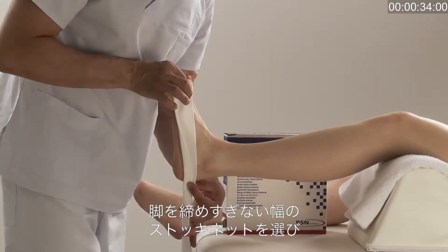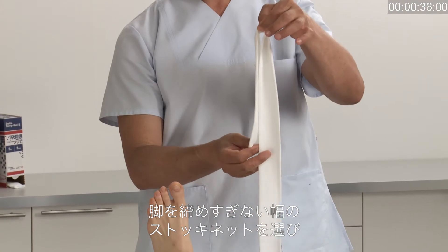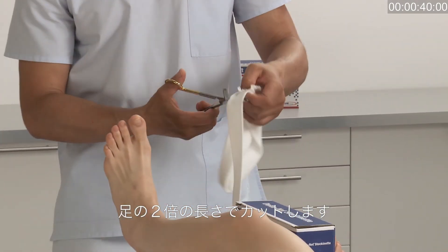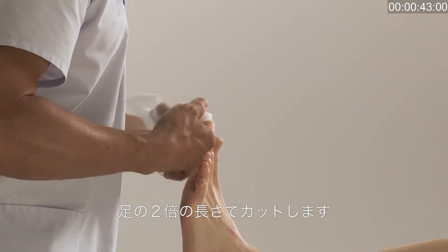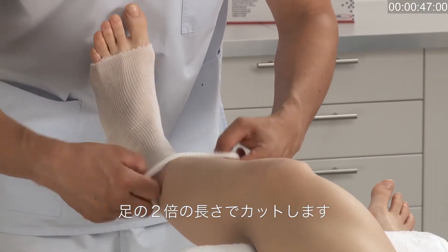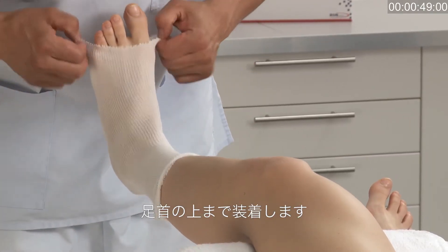Choose the appropriate width of stockinette that will fit snugly but does not constrict the patient's leg. Measure along the length of the foot, double up and cut. Roll up the stockinette before applying on the limb to overcome sliding pressure during application.